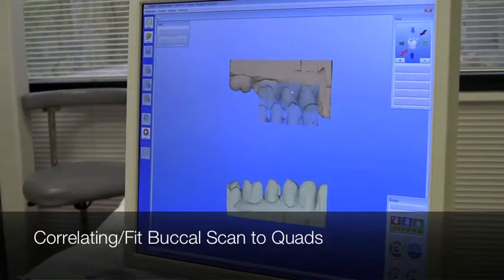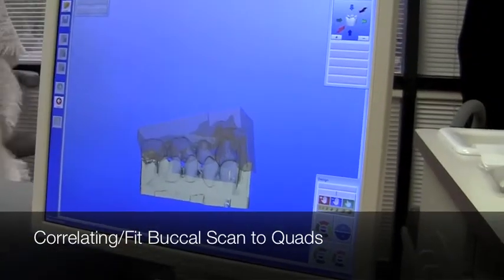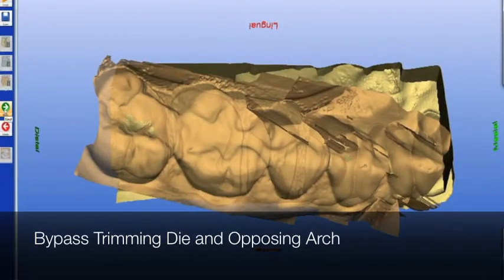We use the form tool and that's about it. We like to dink — we sit there and often we overwork it, particularly with the biogeneric design. Sirona has set up the software to work for you and me. It should be fast; it shouldn't take us a long time. Window one is correlating my buccal scan and quadrant relationship. Window two — I bypass trim. That's trimming the model and I bypass trimming the opposing arch.